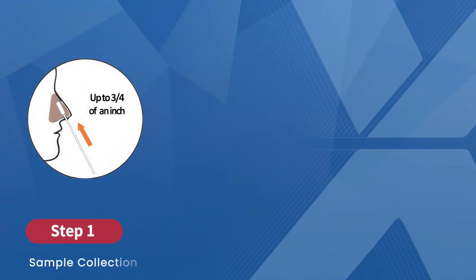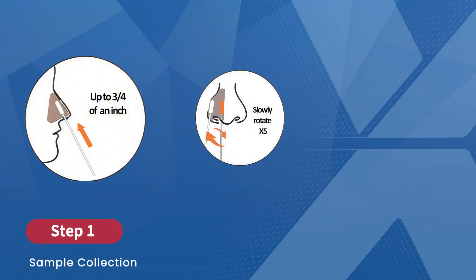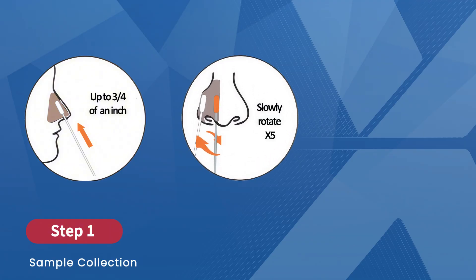First step: sample collection. Take one swab and put it into the patient's nostril — no more than three-quarters of an inch for adults, or half an inch for kids. Slowly rotate the swab for about 15 seconds, pressing gently to collect as much nasal discharge as possible.